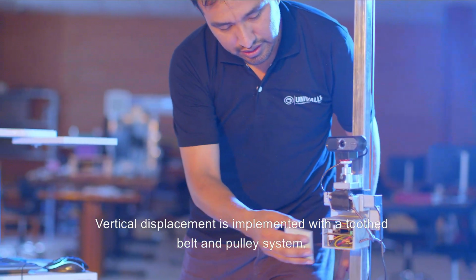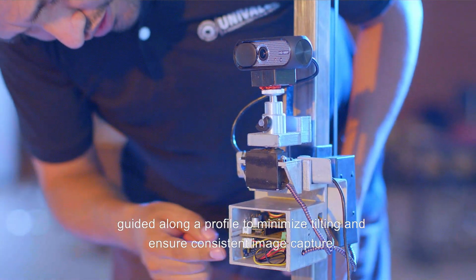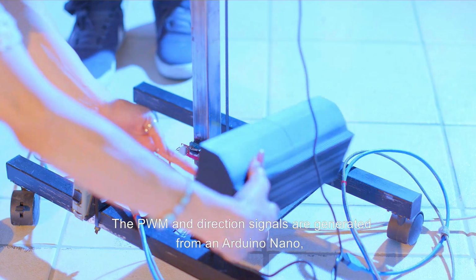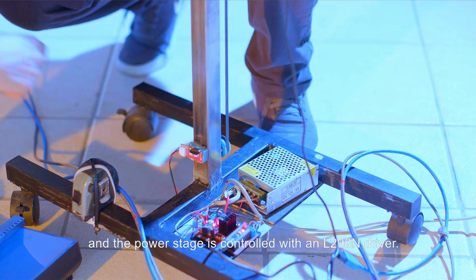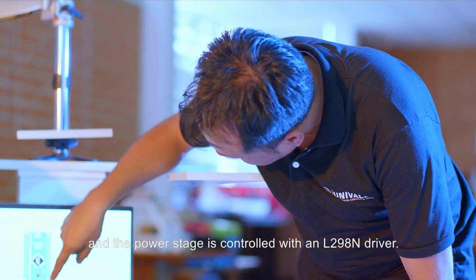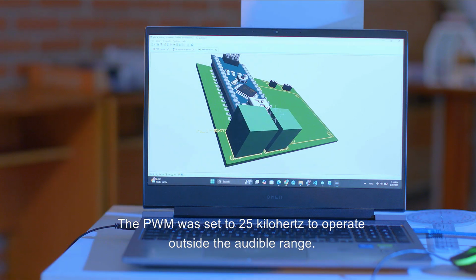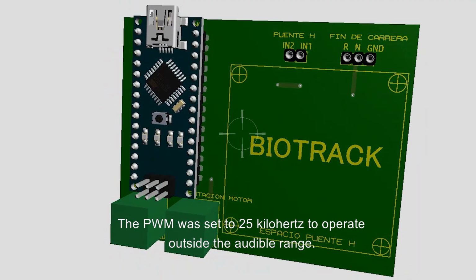Vertical displacement is implemented with a toothed belt and pulley system, guided along a profile to minimize tilting and ensure consistent image capture. The PWM and direction signals are generated from an Arduino Nano, and the power stage is controlled with an L298N driver. Logic-level, current margins, and actual voltage drops of the system were verified. The PWM was set to 25 kHz to operate outside the audible range.